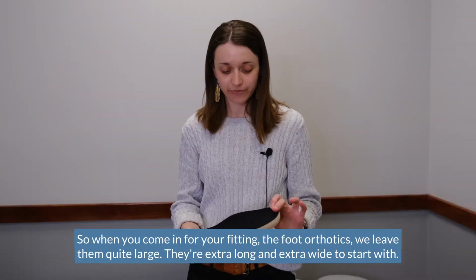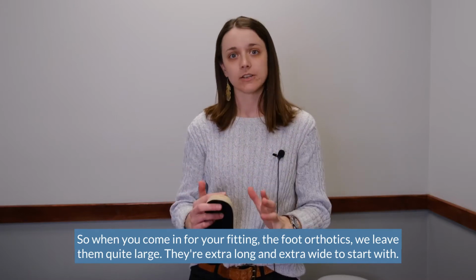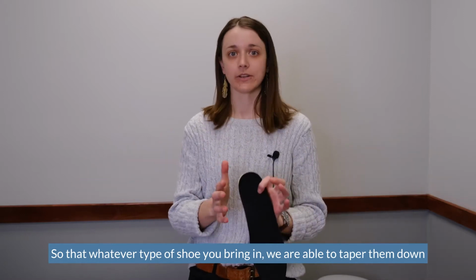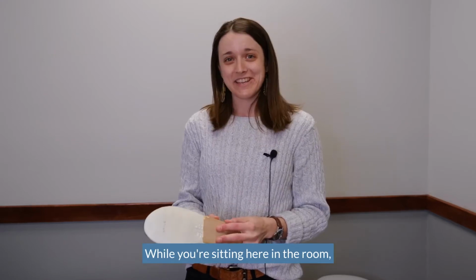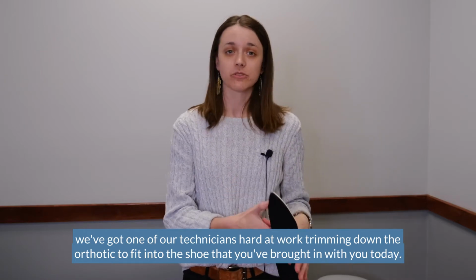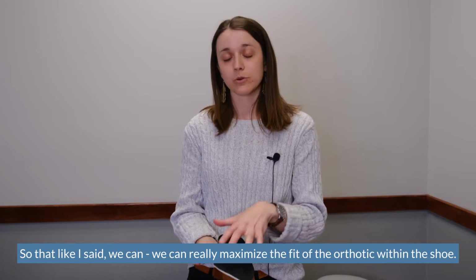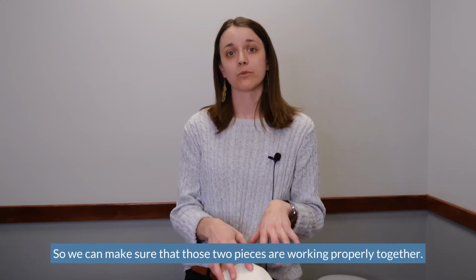So when you come in for your fitting, the foot orthotics, we leave them quite large. They're extra long and extra wide to start with, so that whatever type of shoe you bring in, we are able to taper them down and get them to fit properly within the structure of that shoe. While you're sitting here in the room, we've got one of our technicians hard at work trimming down the orthotic to fit into the shoe that you've brought in with you today, so that, like I said, we can really maximize the fit of the orthotic within the shoe, so we can make sure that those two pieces are working properly together.